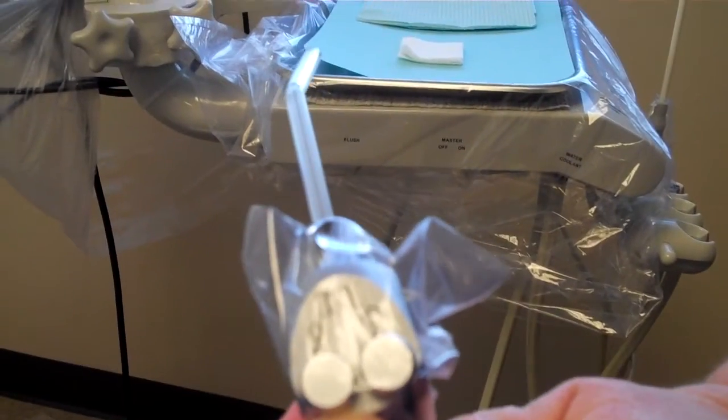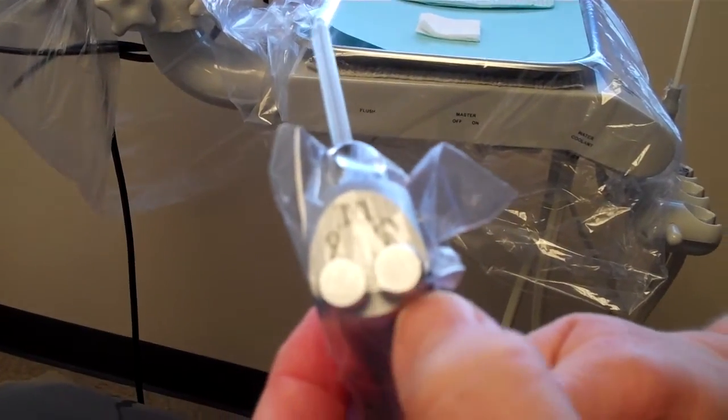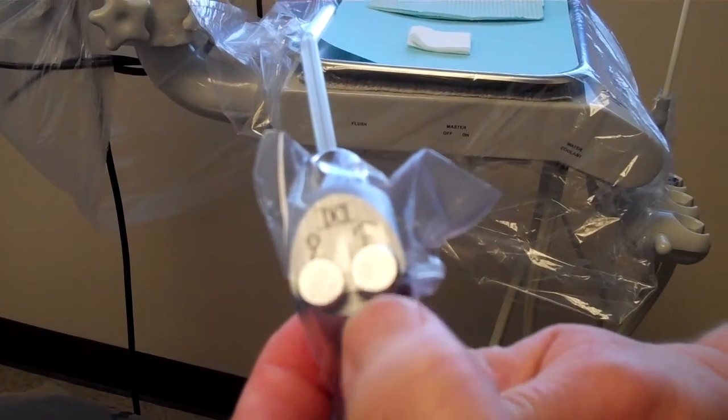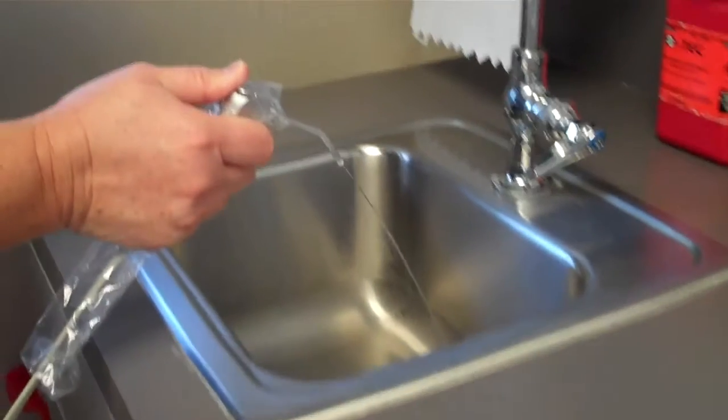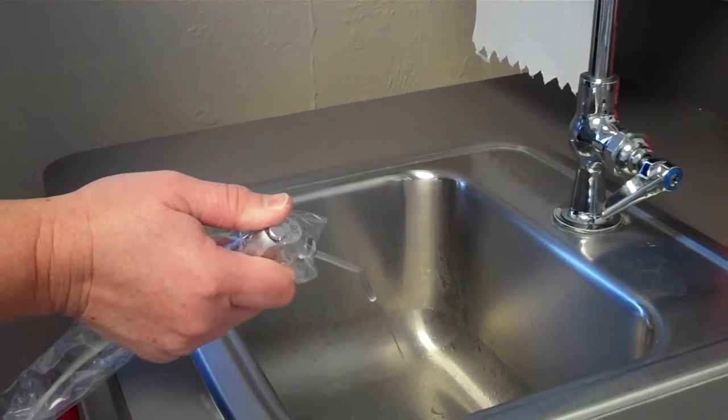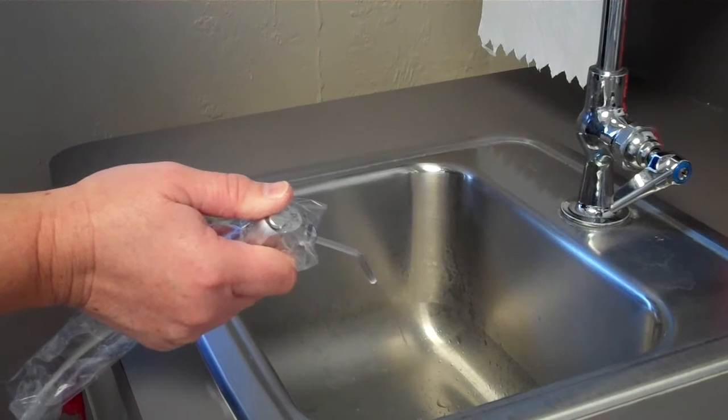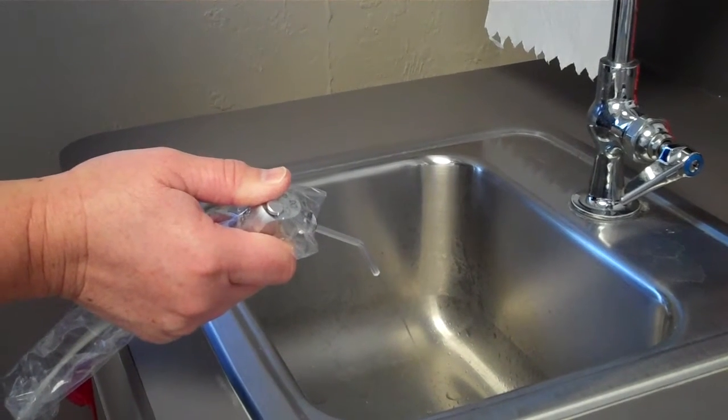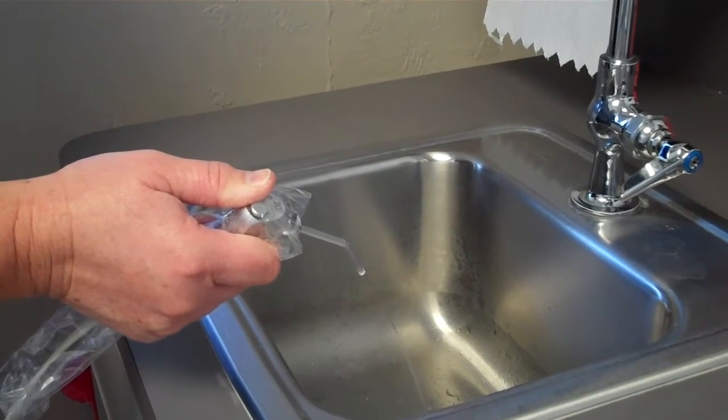And what you're going to do with the air and water syringe: the button on the left has a teardrop and the one on the right has a cloud. We're going to depress the teardrop for two minutes, and we will drain this water for two minutes prior to the start of our day. This will be before any morning huddle that occurs. You'll hold this button down for two minutes.